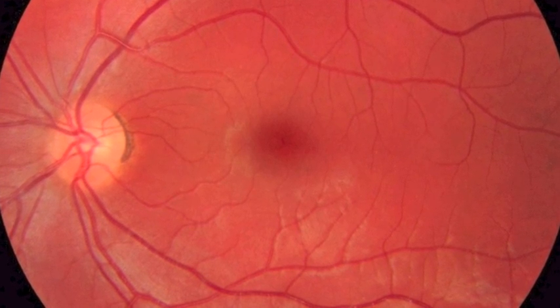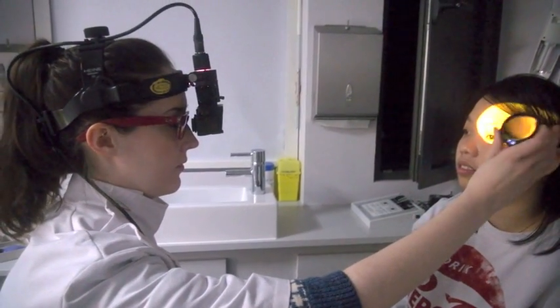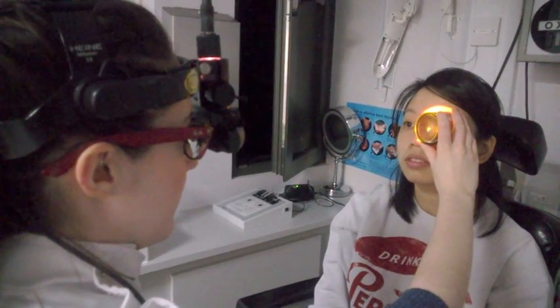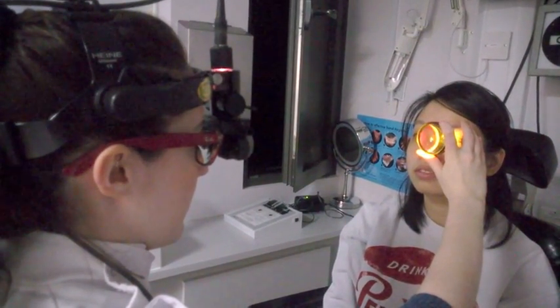The illumination of the headset should be turned down to around a third using the rheostat. The beam should be directed into the patient's eye. You can then introduce the condensing lens. This should be held between the thumb and forefinger with the side with the white ring facing away from you. Hold the lens at arm's length and around 2 cm from the patient's eye.